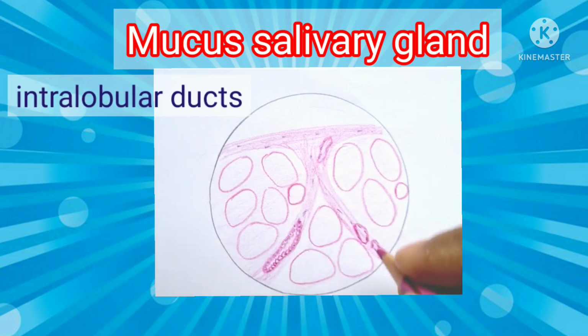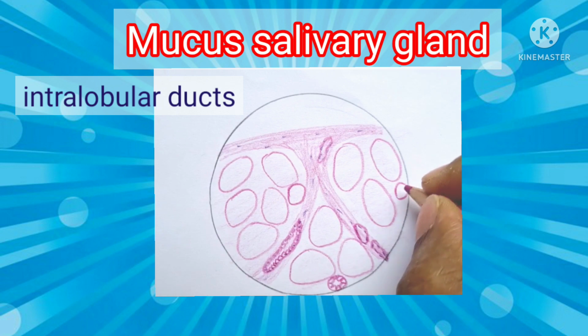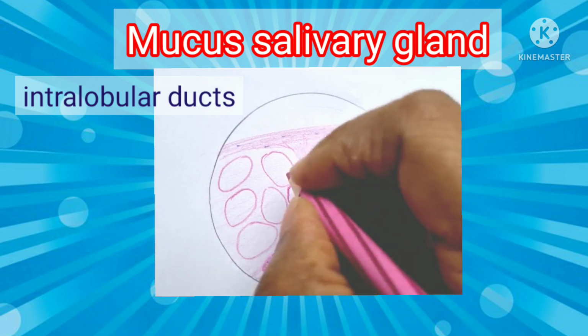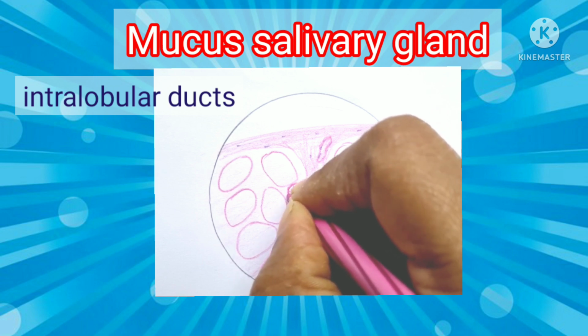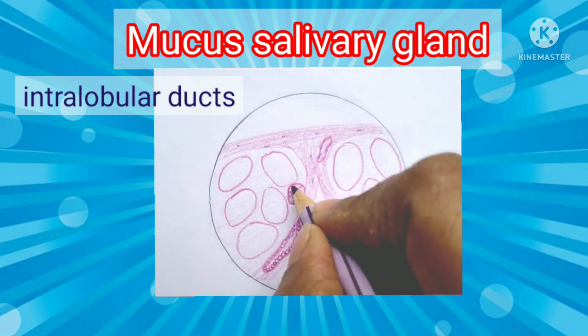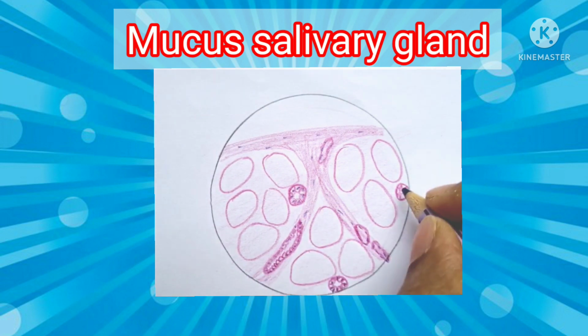And make sure you draw the intralobular ducts, that is, the intercalated and striated ducts. The number can be less. Here these ducts don't modify any secretions. They just function in transmitting the secretion secreted by the mucous acini, so the intralobular ducts are less in number.